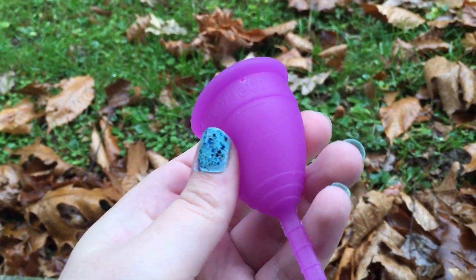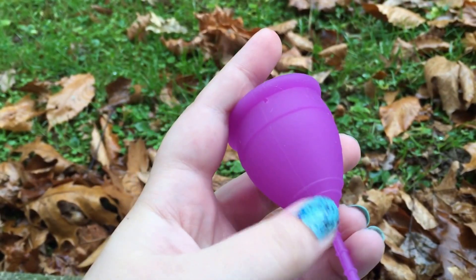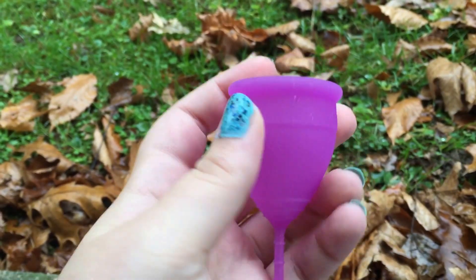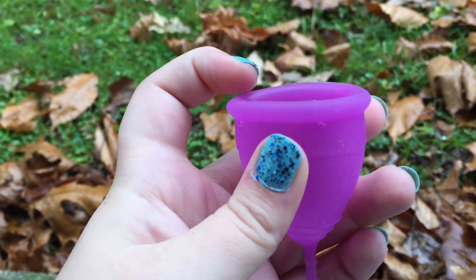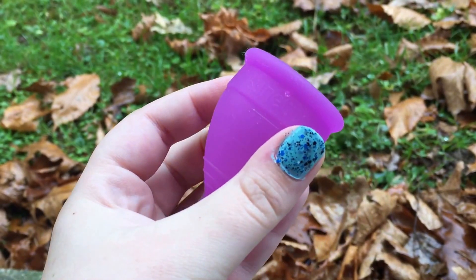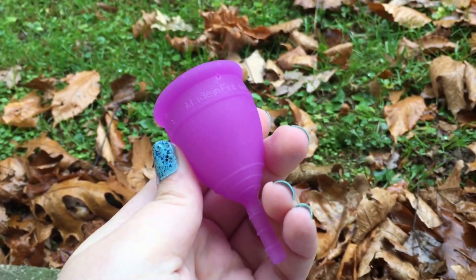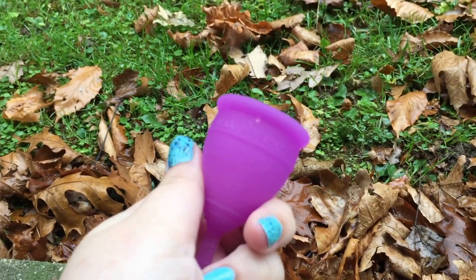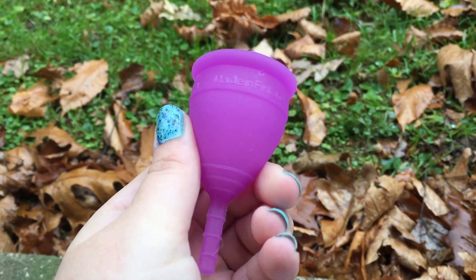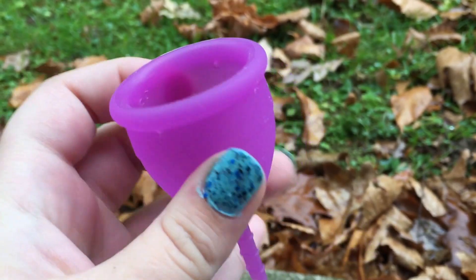There are some seams in this cup — a seam running along the side on both sides, and there's one around the top of the cup. There are four air holes. It has the Lunette name on the outside and it also has 'Made in Finland.'